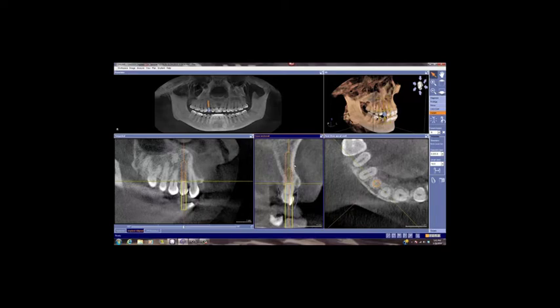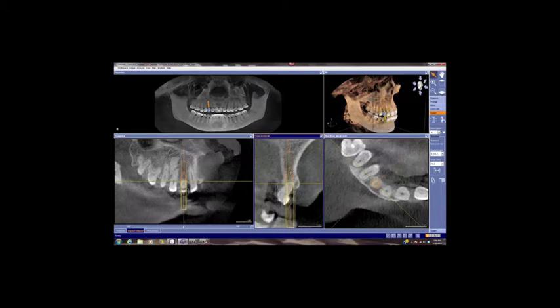And when we have a very thin buccal plate in this type of case, since we have to graft this anyway, I would prefer to place a 4.1 millimeter implant, especially in a case like this on a canine, which in this patient's occlusion is going to be a major load-bearing tooth. So I would rather do a 4.1 millimeter implant since we have to graft this case anyway. That way we can have a stronger implant. Here is the example as shown here.